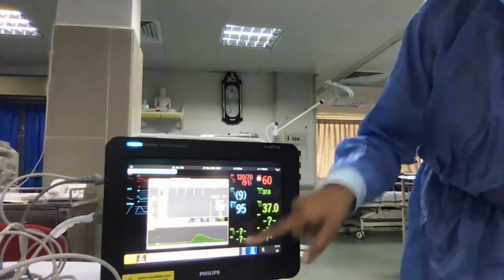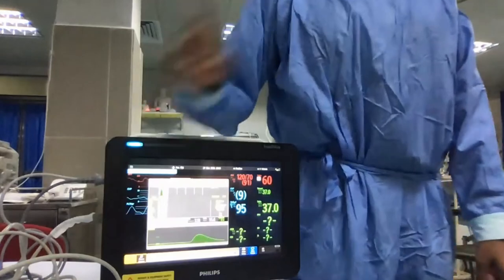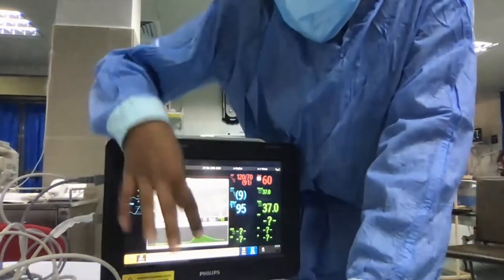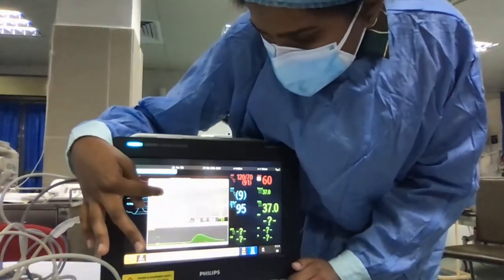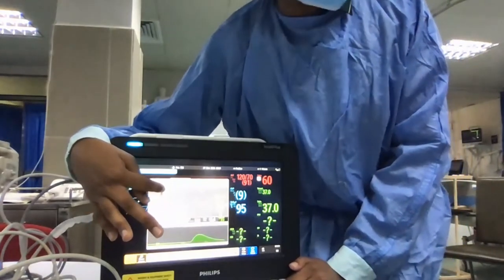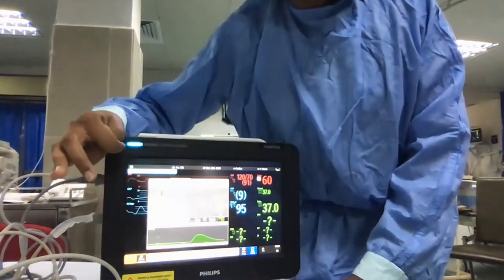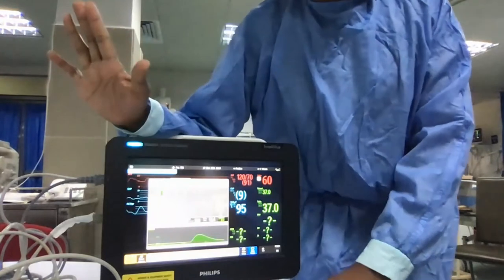Okay, so this is our curve. How do we know, Vindya, that the bolus is effective or not by looking at the numbers? A good question, madam. You will get a cross mark over here if the reading is not accurate, and you have to do it again. If you get a green tick over here, then your injection is accurate and I can proceed on with the reading.